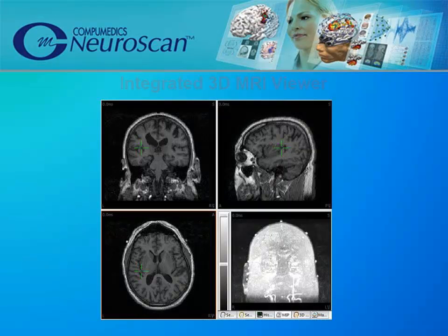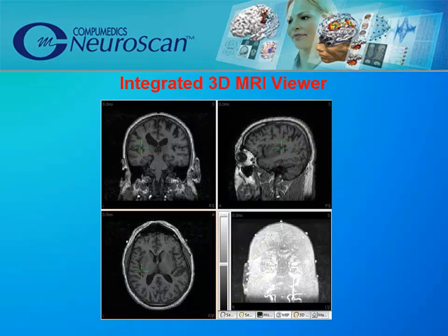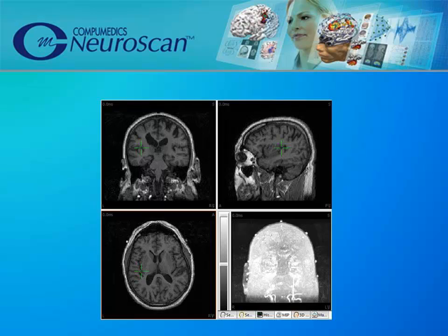A sometimes overlooked but often appreciated feature of CURRY is its ability to take single perspective MRI images and convert the flat voxels to voxel cubes that allow viewing from three perspectives: axial, coronal, and sagittal. Moving the crosshair in one view affects the others too. A maximum intensity projection provides another x-ray type view.